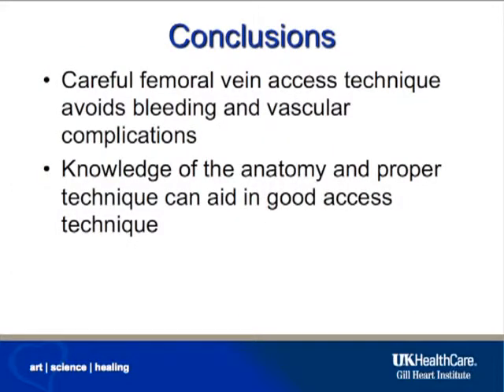In conclusion, careful femoral vein access technique avoids bleeding and vascular complications. Knowledge of the anatomy and proper technique can aid in good access technique.